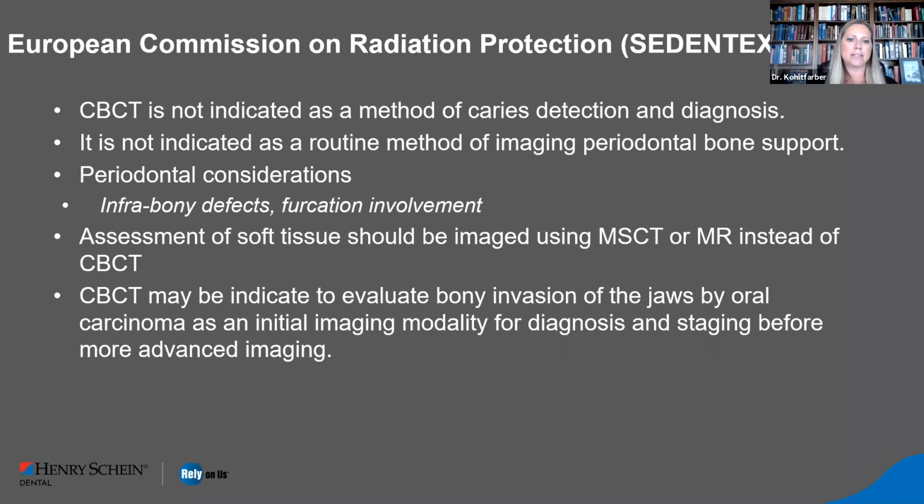CBCT is not indicated as a method of caries detection. Very, very good. That's an excellent comment. We have a lot of beam hardening artifacts with CBCT, a lot of false positives. Now, the research does show that if the patient has no other metal in their mouth and they have deep caries, that CBCT will show the depth better than 2D imaging. But again, we have to be real careful with that. I would say we definitely haven't moved beyond those intraoral bitewings in a patient that has multiple caries. We still need to take those, maybe even along with the CBCT, to better evaluate the carious process.